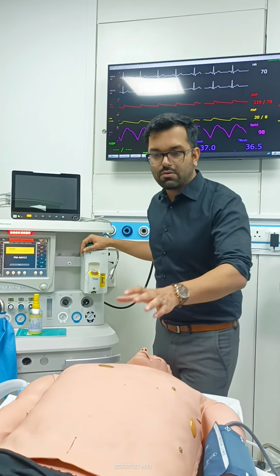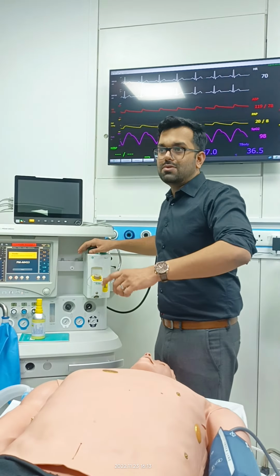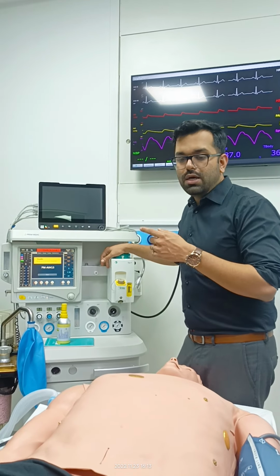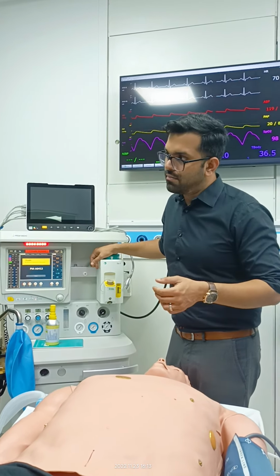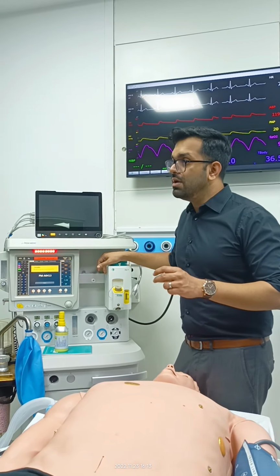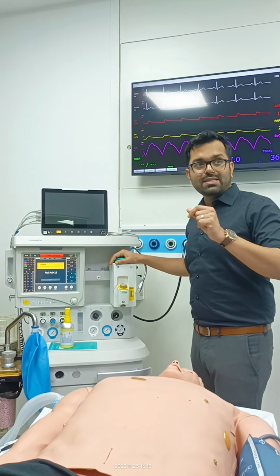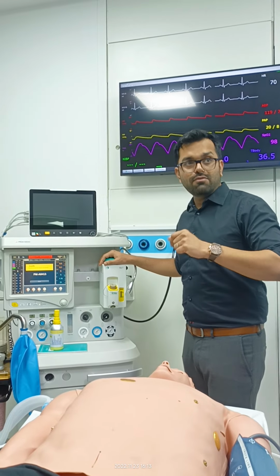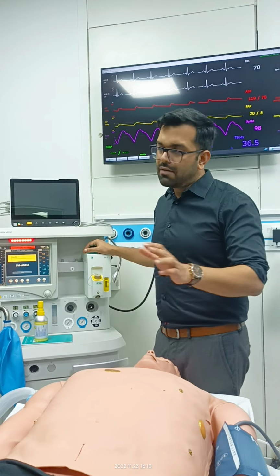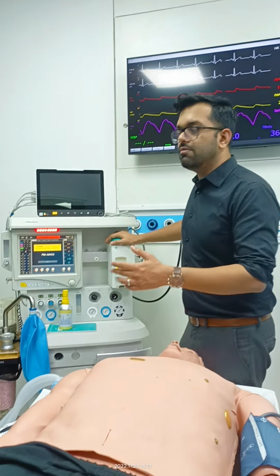The moment you decide that skin closure is going on, depending upon the agent, you can switch it off. Like for isoflurane, it takes some time to come out of the body, so you can switch it off early. Sevoflurane, while your last suture is going on, you can switch it off. With desflurane, the beauty is it's so fast acting, onset is so fast and reversal is so fast. The moment you stop it, after 1 minute, the patient will open the eyes. So depending upon the agent, you decide when to stop.